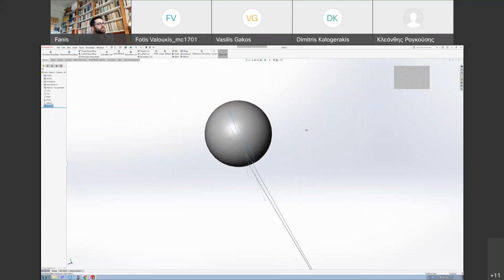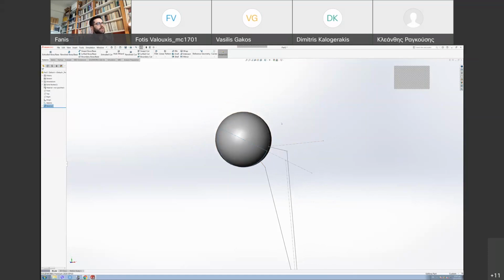Now something to keep in mind when you're working with spheres, sometimes it can be tricky to attach a handle or something to a sphere, because if that was, for example, a flat surface and this is a sphere, they essentially share just one point. Okay, so to tackle that, there are a number of solutions. I'm going to show you the most simple one, actually.